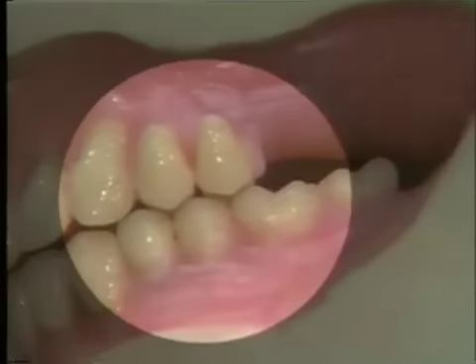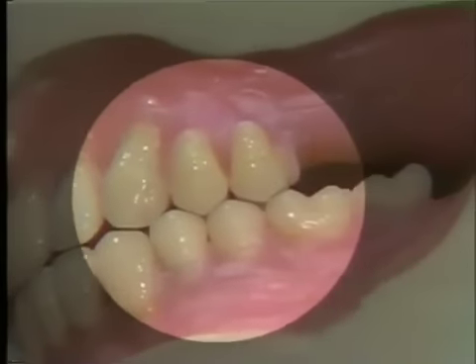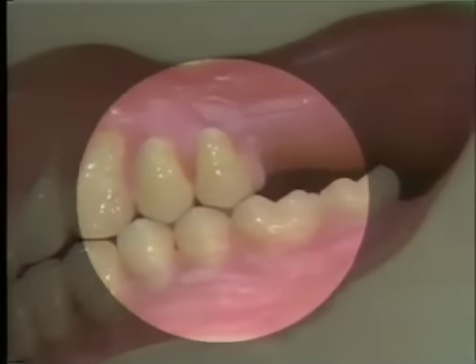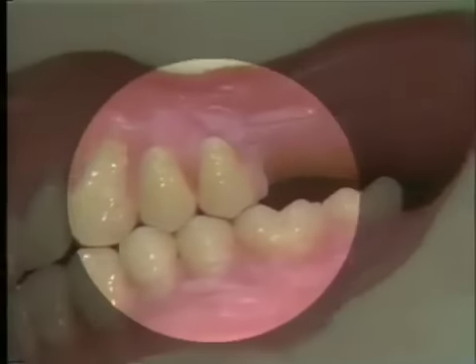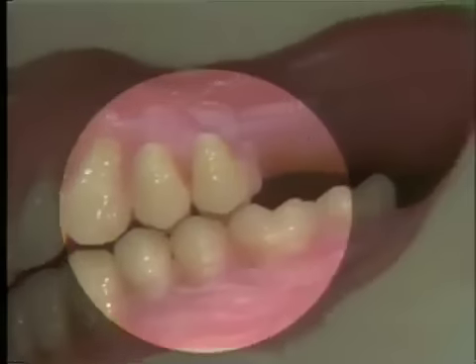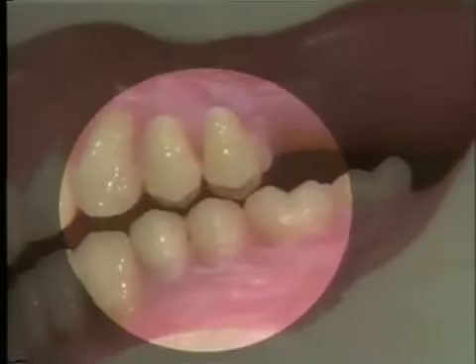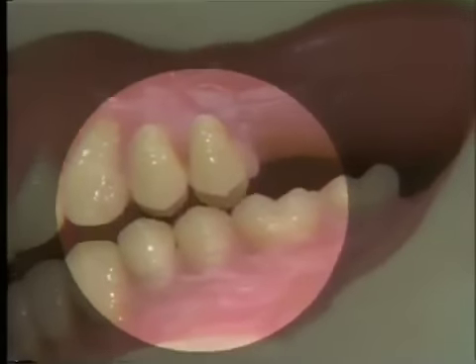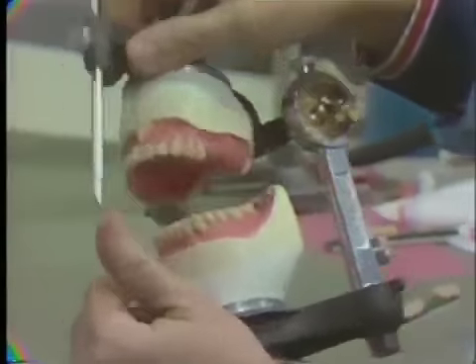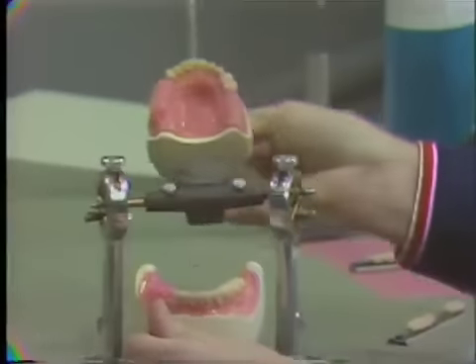I've put just a little bit more wax there so I can move the tooth around slightly. As I move the upper arm of the articulator away from me I'm really bringing the jaw into working toward me, and this time as you can see it comes through the embrasure pretty nicely. Now the balancing of the denture is actually refined at a later date by grinding on the teeth. At this time we want to come as close as we possibly can by setting the teeth in a relationship that they can be balanced, and then later by minor adjustments by grinding on the occlusal surfaces. That's pretty close for the time being — let's go to the first maxillary molar.